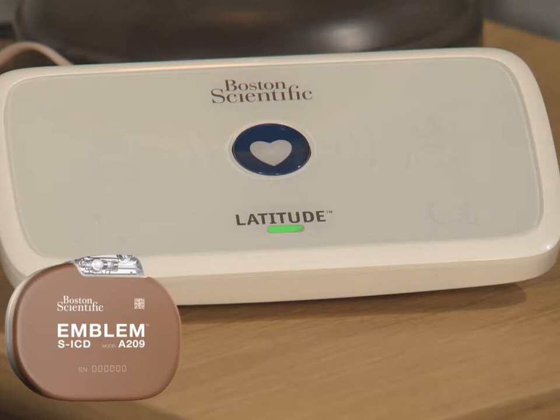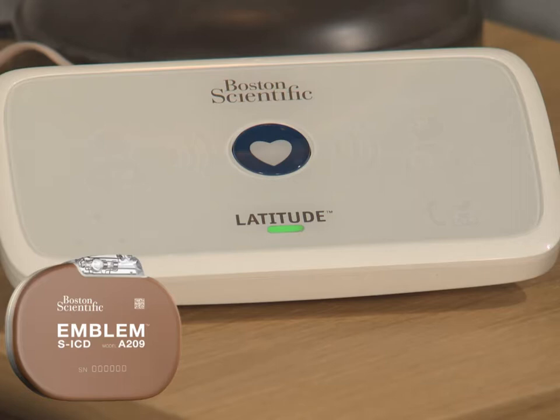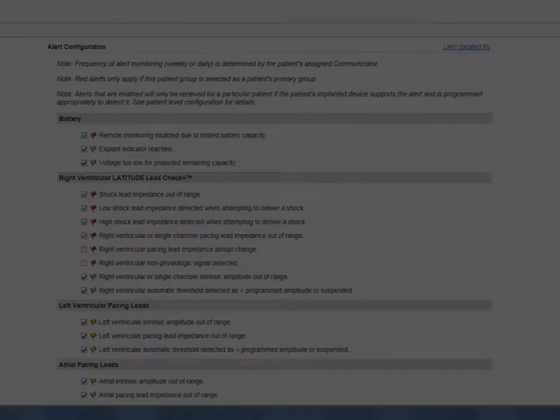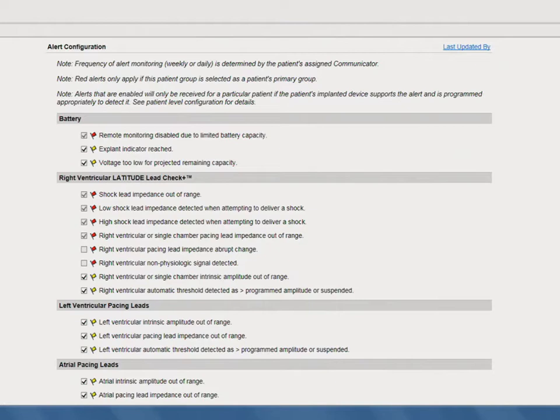These patients are prompted to complete these checks by a white flashing heart. To complete the alert check, patients simply press and release the flashing heart button and remain near the communicator until it is complete. Red alerts are generated based on implanted device conditions that could potentially leave your patient without available device therapy.